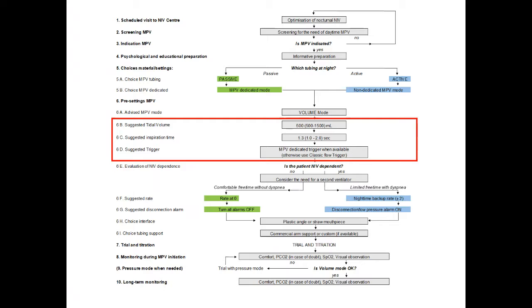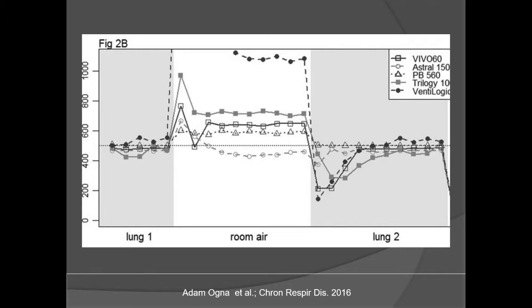So I told you regarding the setting that we can suggest a tidal volume, and among the experts, the expert panel during the Amsterdam meeting, we didn't totally agree on the initial setting of volume. Some said start with half a liter, and some others said, no, you have to start immediately with much higher volumes.